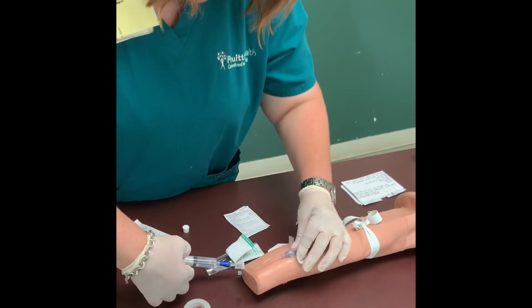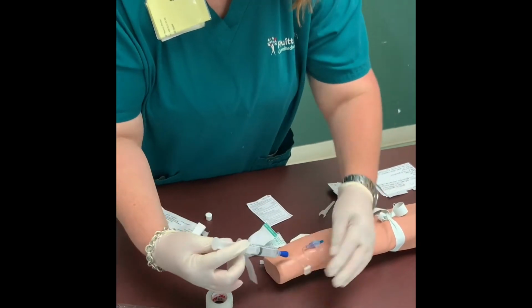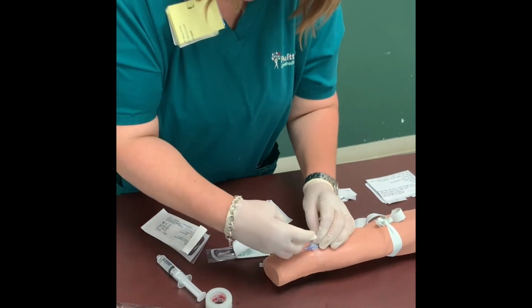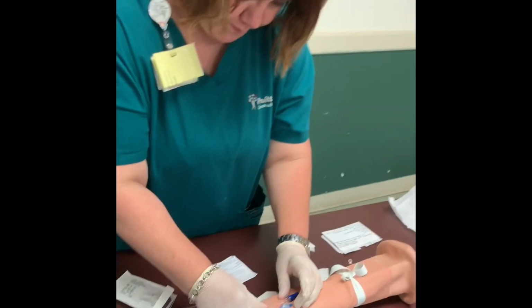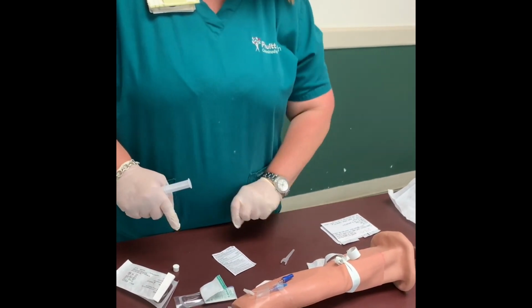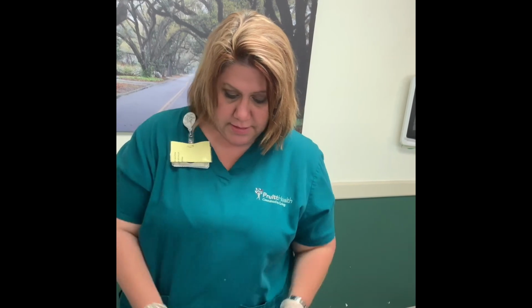Oh, sugar. Some people don't like for them to dangle, so we tape it up. And there you have it. Those are all the steps, and those steps are provided from the Lippincott Procedures IV insertion site.